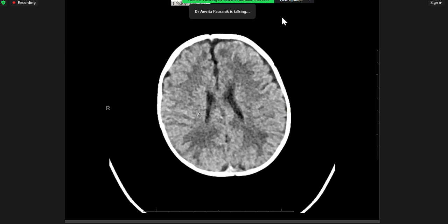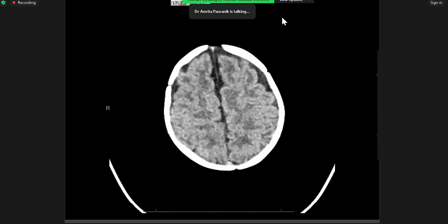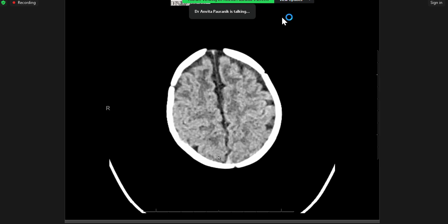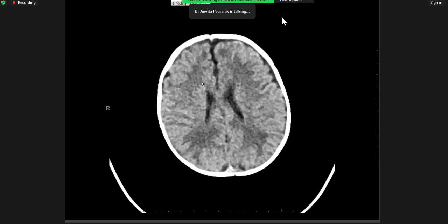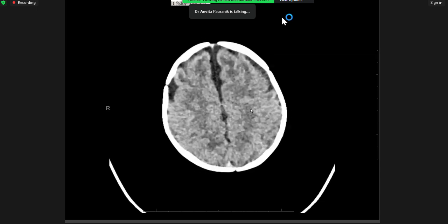So, number one take home message, do not use the words clinical correlation. We use clinical history and ask specific questions. Second, the next time you have PACS in front of you and you have time, spend 30 minutes looking at multiple, if not at least 5 or 10 studies. Just open randomly, okay? Don't even look at the clinical history. Arrange them by date of birth and get comfortable with what is the normal range of density of the venous sinus, what is the normal range of low density in the white matter, can ventricles be small or big, and how wide extra-axial spaces can be.